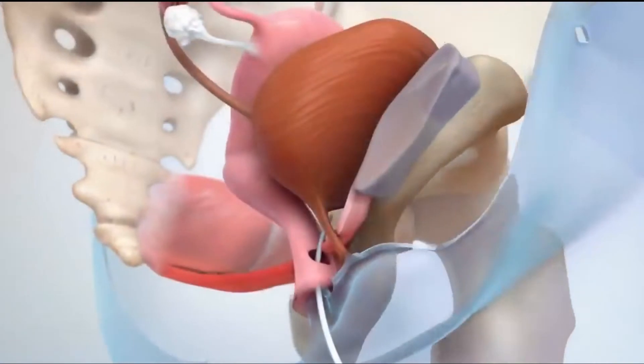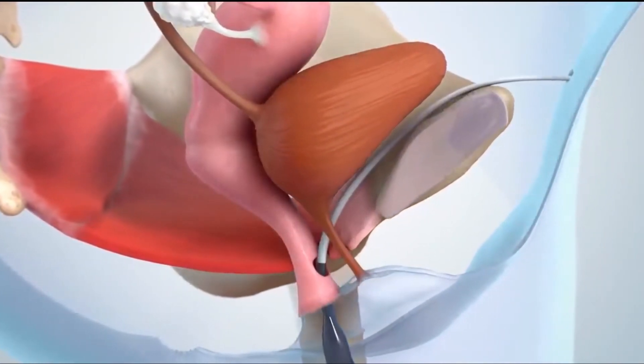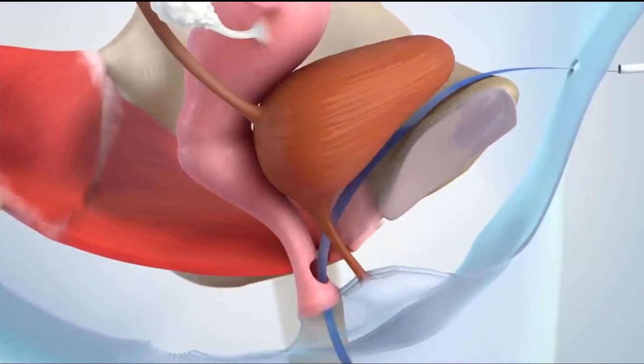A needle will be passed through this incision into your body and out of one of the incisions in your abdomen. A mesh tape attached to the needle will be pulled along this path.